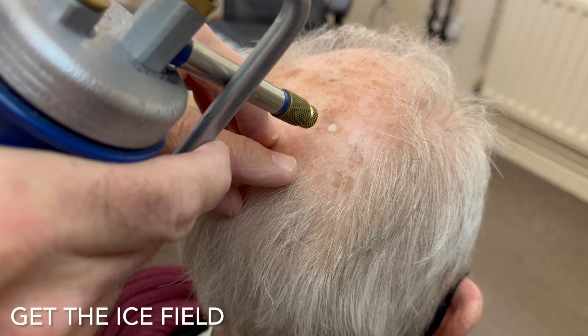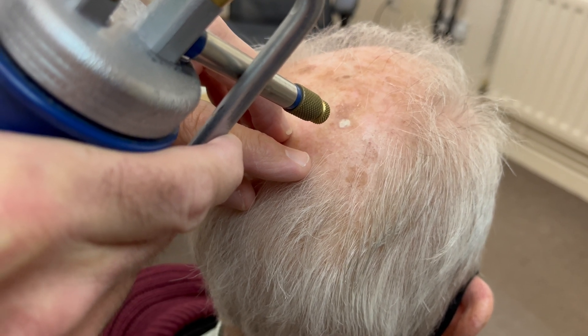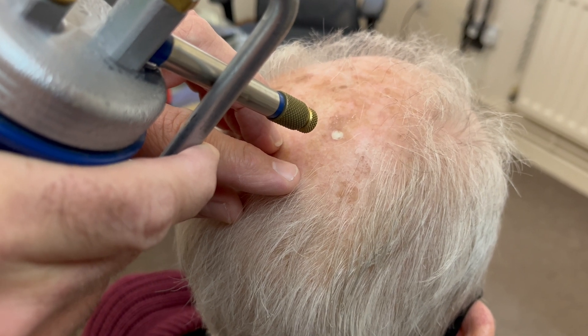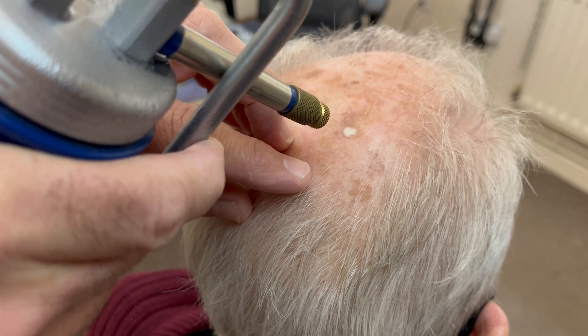So here we're getting the ice field. We're establishing the treatment area, having identified the solar keratosis. We're then freezing it for five seconds to make sure that the lesion is adequately treated.